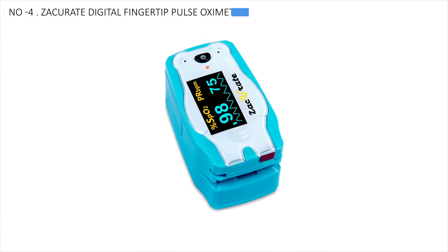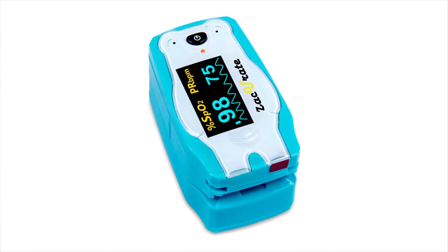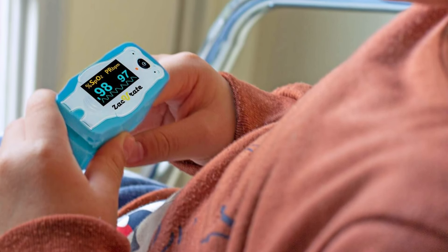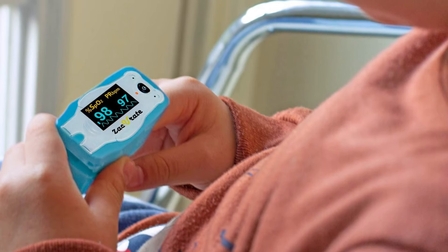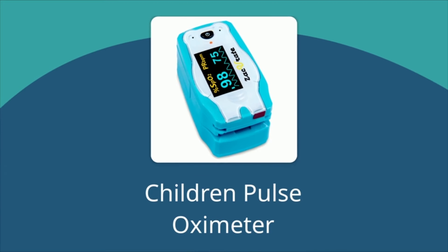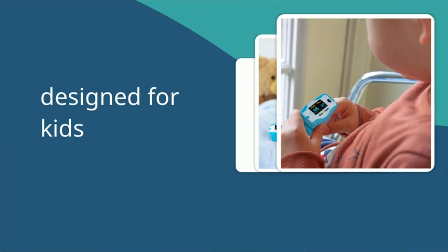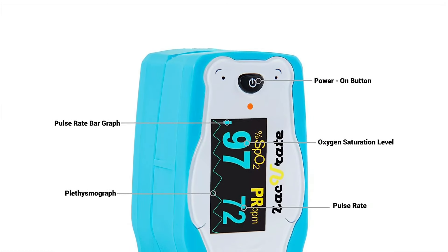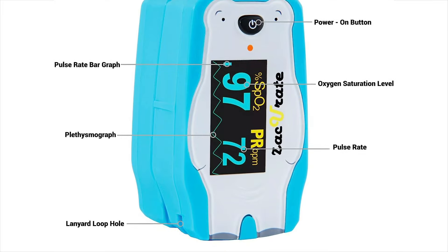Stepping into fourth place, the Zaccurate Digital Fingertip Pulse Oximeter stands out as the best easy-to-use option. The Zaccurate Children Digital Pulse Oximeter is specifically designed for children aged 2 to 12 years old. It features a cute cartoon polar bear design on the face, making it appealing to kids. Despite its child-friendly appearance, it functions like other pulse oximeters. Users simply press the polar bear's nose, place their finger in the small finger port, and within about 7 seconds they receive SpO2 and pulse rate readings.